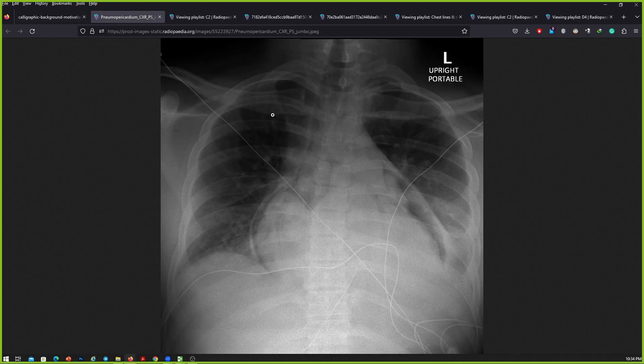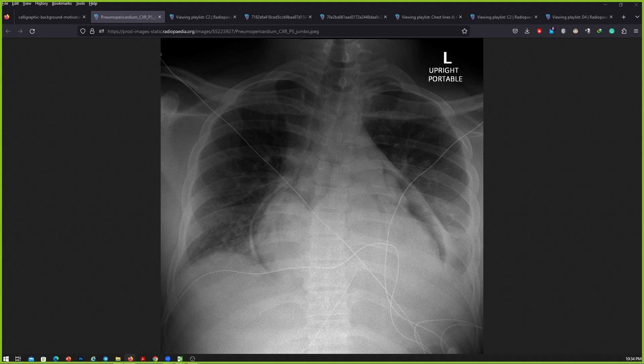First case. Provided to me is the frontal chest radiograph of a skeletally mature patient. I can see the main findings as lucency around the heart, which is limited by the membrane, so this is suggestive of pneumopericardium. There is also homogeneous opacity noted in the left mid and lower lung zone with partial obscuration of the hemidiaphragm and costophrenic angle, most likely due to pleural effusion.